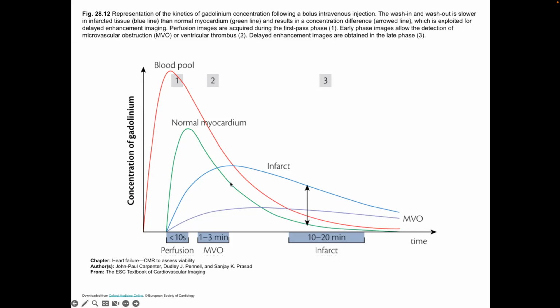So normally you would try and do something with this time, like make movies of cardiac function is one thing. Another possibility is to make flow images. As we'll see later, with MR, you can estimate the flow for each voxel. You get a vector actually saying what the flow is over time. We could do that, okay? And then you go back and do this image at 15 minutes to get whether or not there's infarct in that heart.